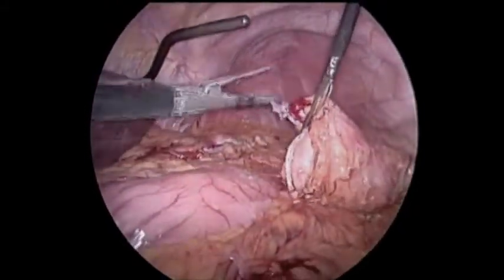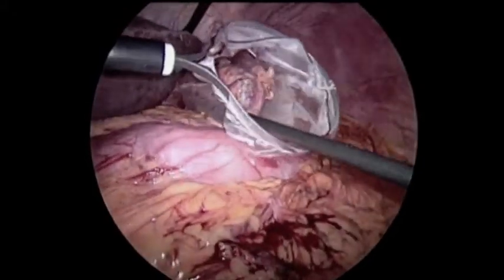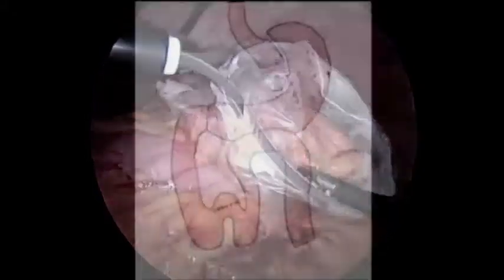We put a ruler inside so we could measure the gastric pouch — it was 15 centimeters long. We wanted to reduce it to about 4 centimeters, more in keeping with our standard Roux-en-Y gastric bypass. It took two firings of the blue stapler to come across that gastric pouch, and we removed the resected portion in a catch bag.